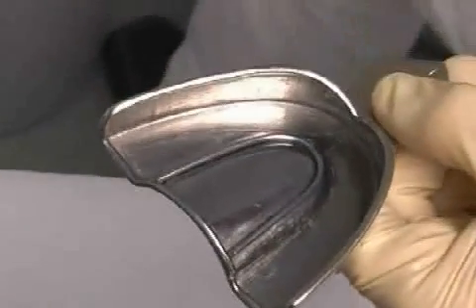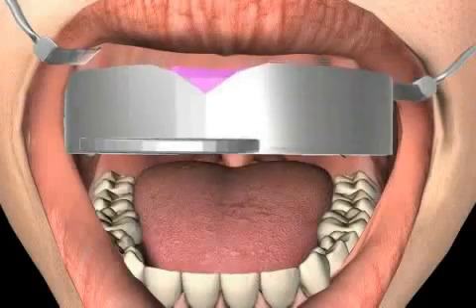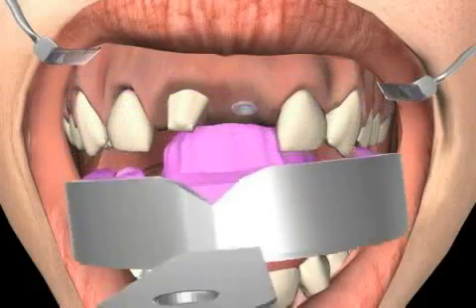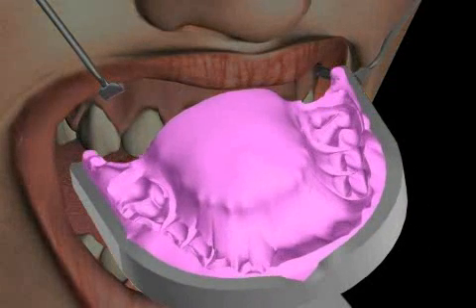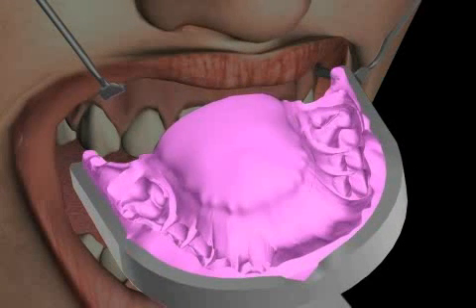Although this certainly complicates the process of cleaning the trays, it results in less distortion of the impression compound. This is important because impression distortions can lead to a leaking dental prosthesis.